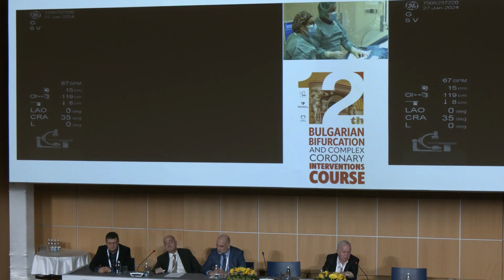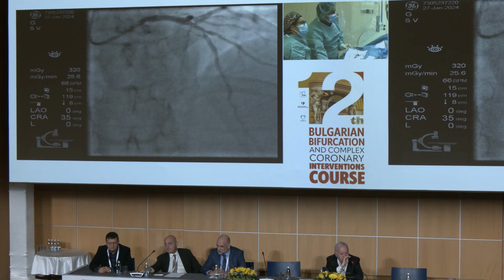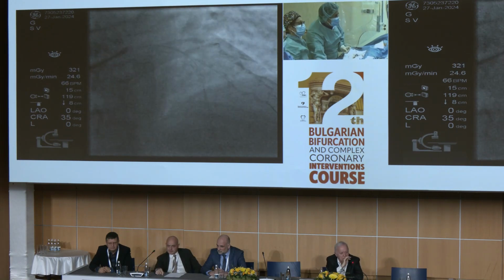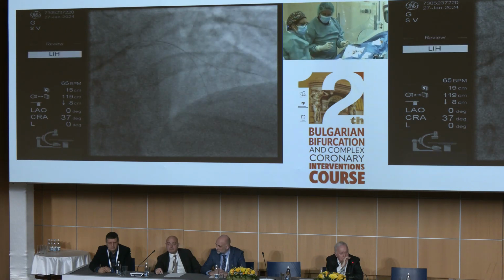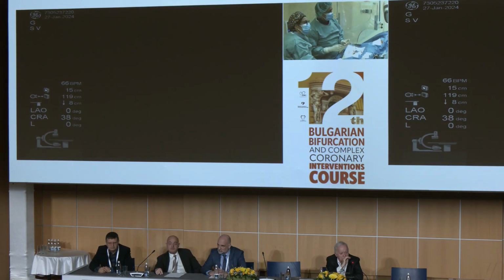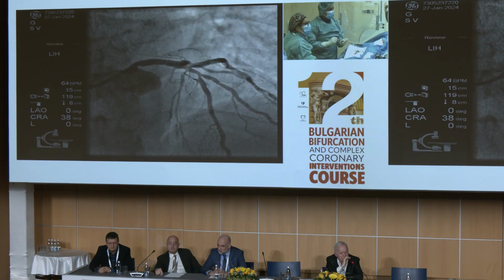That's okay. So let's fill the coronary artery, and maybe we can move now. Since we are going to center on the lesion, we can. Do we film? Ready to film? Perfect. Okay, I'm filming. This is after nitro.